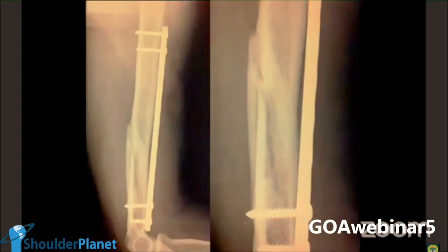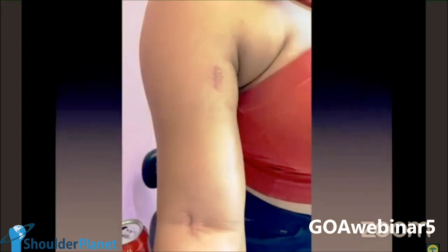See the size of the arm, see the very small incisions, in my opinion, perfectly positioned. And I dare to say that a posterior incision not only causes big, gigantic damage to soft tissue, never academically wrong, but the incision would be, in my opinion, and I'm quite sure, at least as long as the length of the connection between the upper and the inferior, or much bigger, much longer. So I consider this, to be very honest, a revolution. Fat patient, obese, minimally invasive, very small incision. People say it's percutaneous. It's not percutaneous. It's minimally invasive, and in my opinion, maximally resolutive.